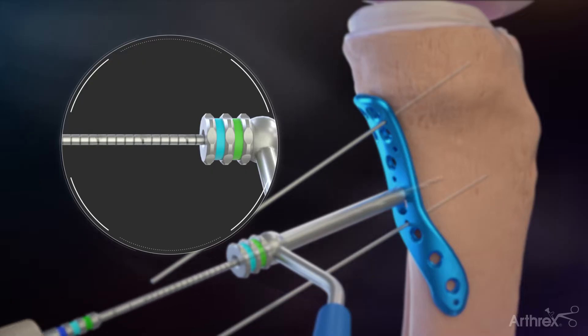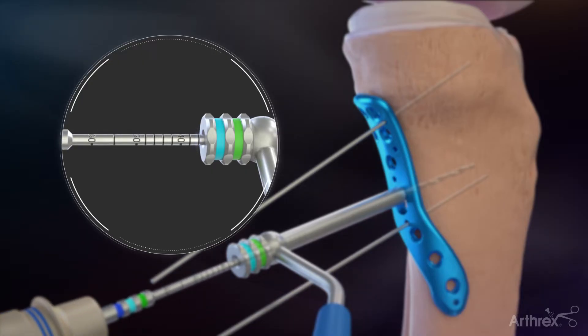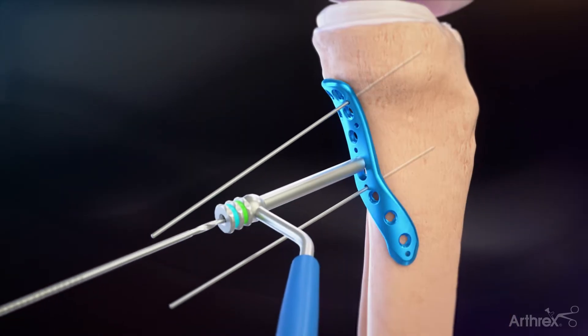Drill through the guide with the 2.8 mm drill bit and use the calibrations to determine the screw length. A hook tip depth gauge can also be used.